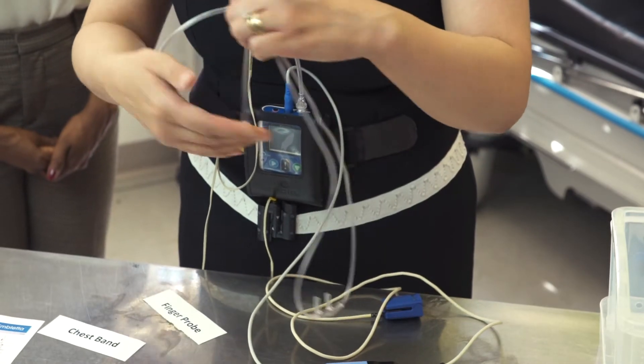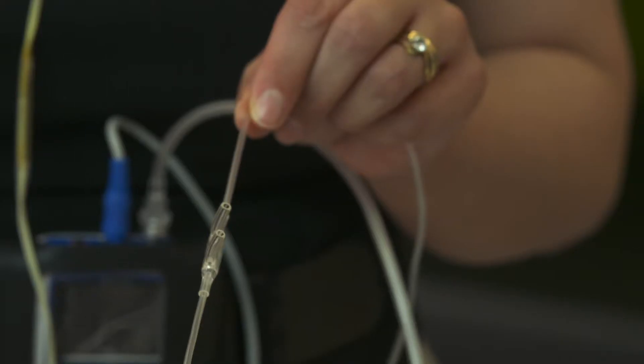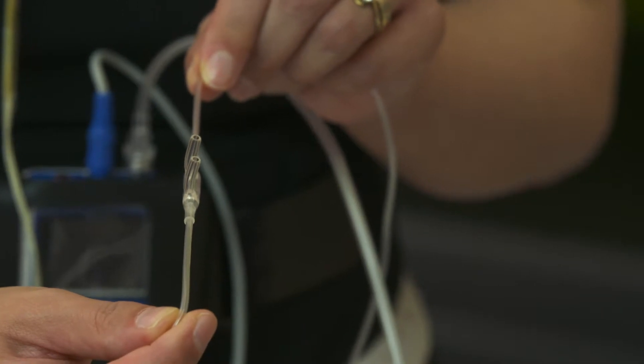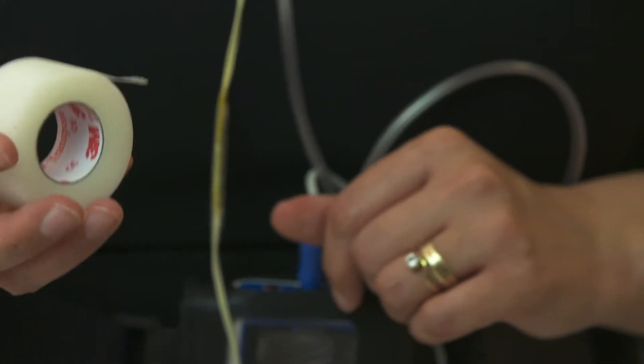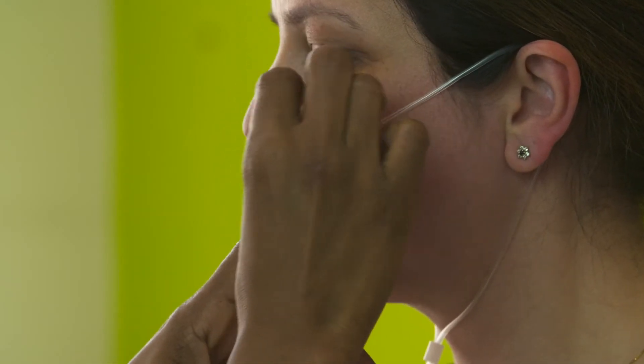The next thing to put on are the nasal prongs. They curve slightly and they curve in towards your nose. Place them in your nostrils, take the tubing over the top of your ears and take up the slack with the white toggle under your chin. Avoid putting it over your head so it doesn't get tangled round your neck. Using the tape we provide, tape the tubes to both cheeks to help secure it and keep it in place.